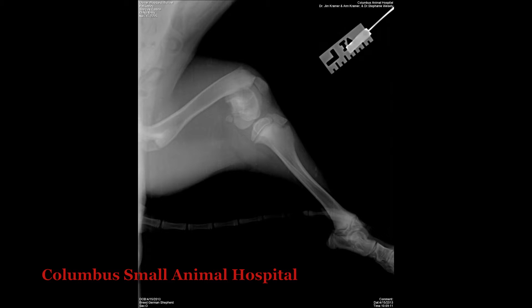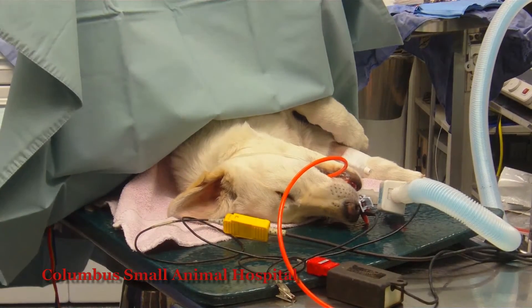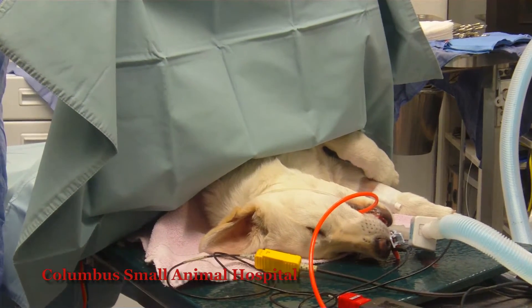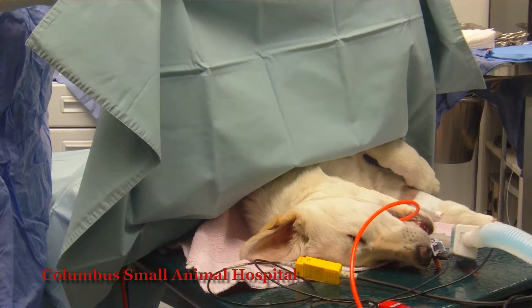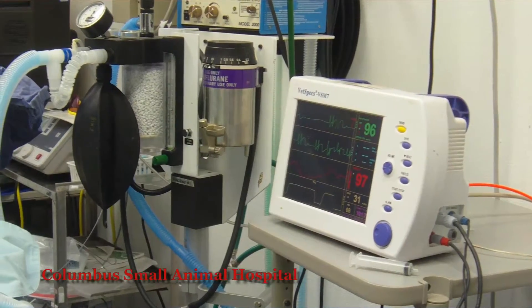Leslie is a young dog and this is an epiphyseal, or growth plate, fracture. Because the growth plates are still open, we cannot put a bone plate or screws across that growth plate, so we will utilize a cross-pinning technique to fix this fracture.